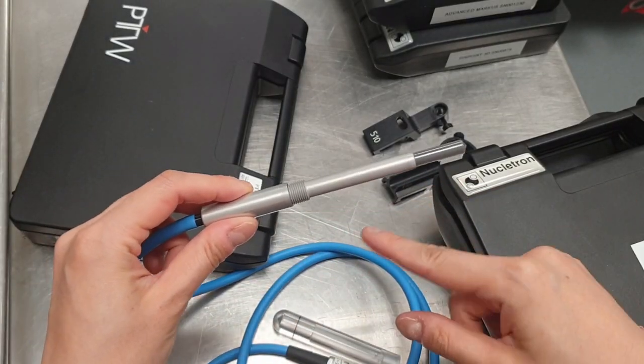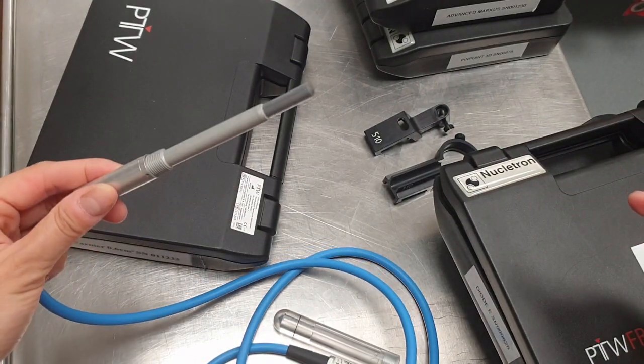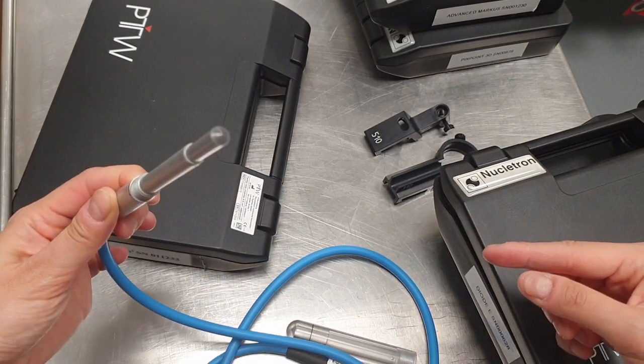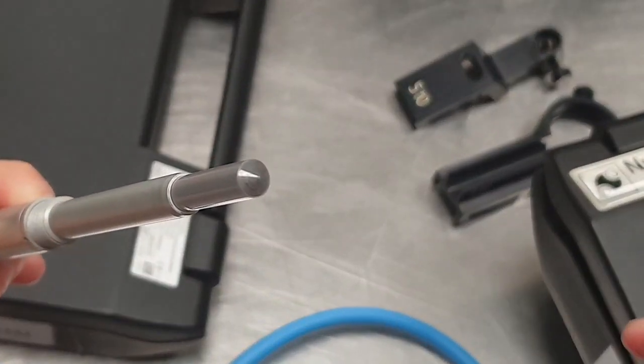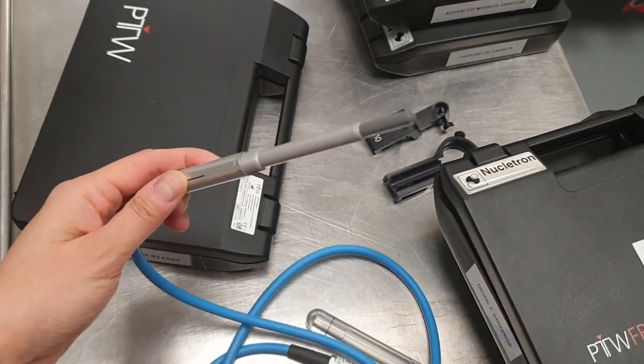This detector has a length of 23 millimeters and 6.1 millimeters is the inner diameter for the sensitive volume. The distance from the detector tip to the effective point of measurement is 13 millimeters. The central electrode is made of aluminium and the wall is a combination of acrylic and graphite.